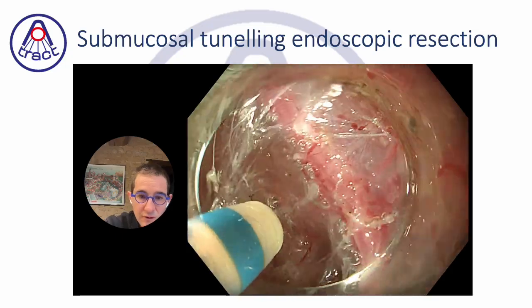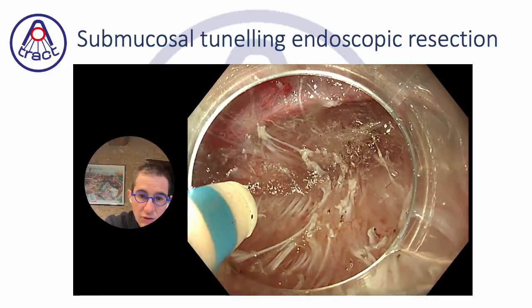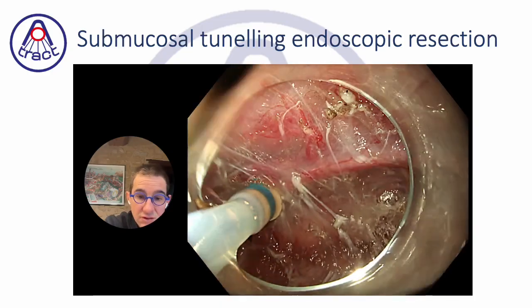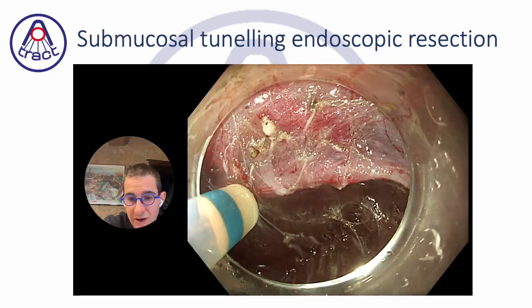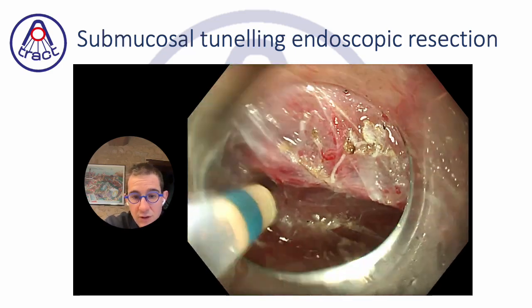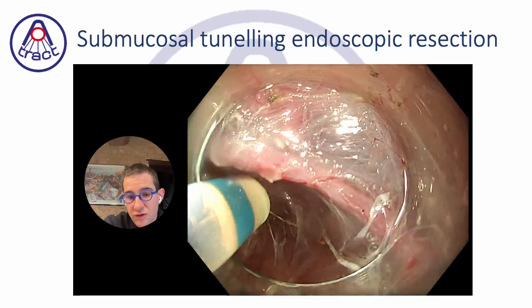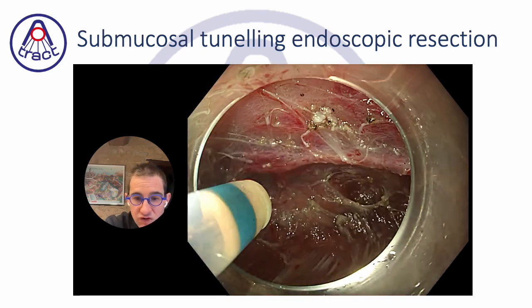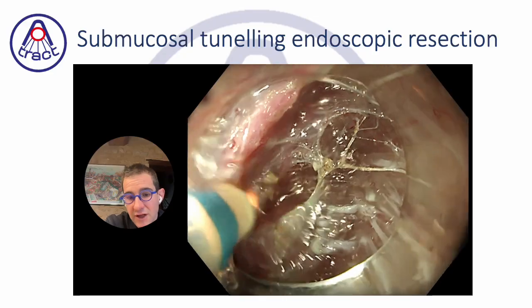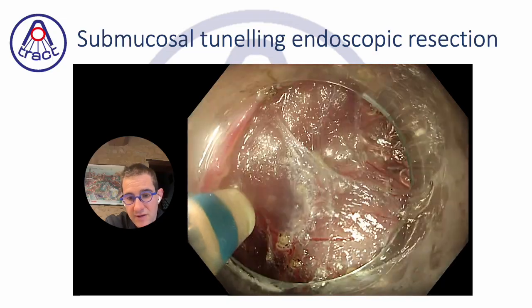So it's very important after to avoid any damage to the submucosal lesion, in order to avoid a non-complete resection or a damage of the capsule of the lesion that makes the resection non-complete and obliges us to maintain a follow-up. Also, this stromal tumor is a tumor with a very low risk in the Miettinen classification. So it's probably something we should consider. If we can have a really complete resection with no contact on the lesion edge, it's better, because we will probably completely forget this lesion and avoid any follow-up after, if the resection is without any damage.